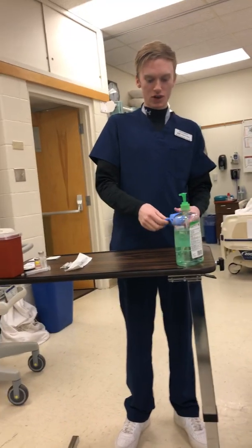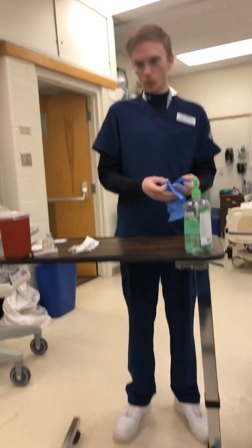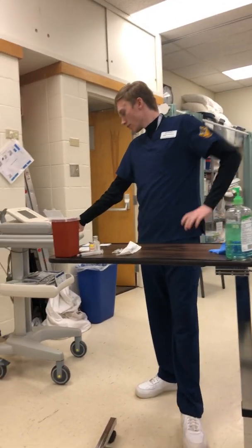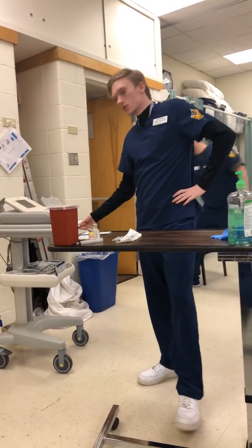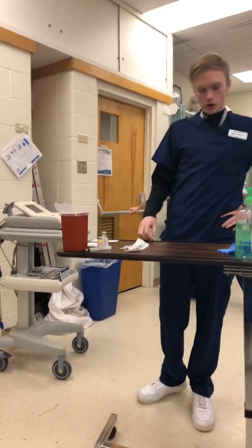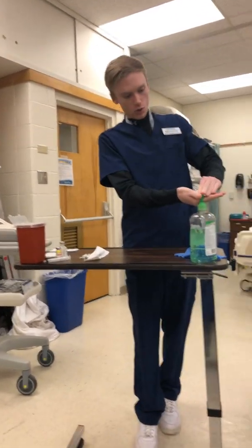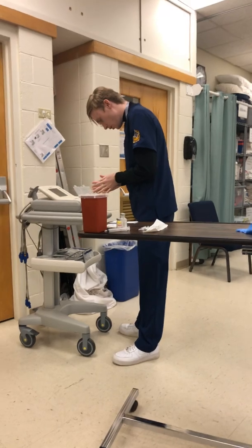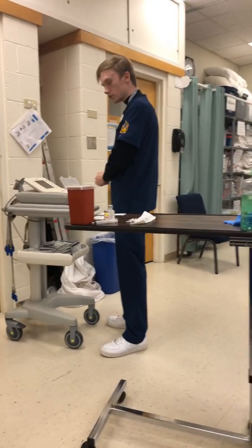My name is Dante Downing, a student at MCC, and we are going to show how to administer an IM injection through the Z-Track method. So to begin, we're going to wash my hands and go over to the MAR to check to see if we have an order. And we do. We have an order for Rocepin 1 gram IM using the Z-Track method.